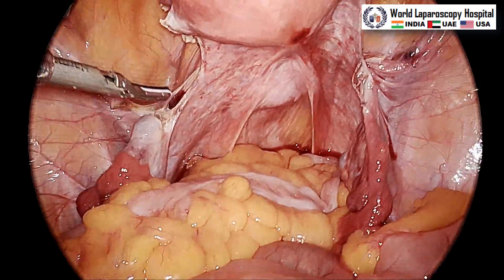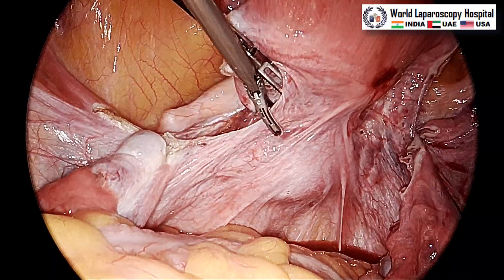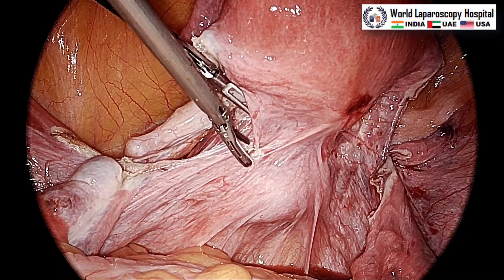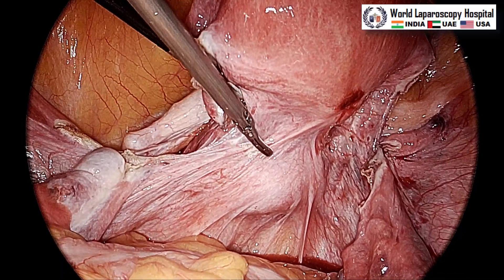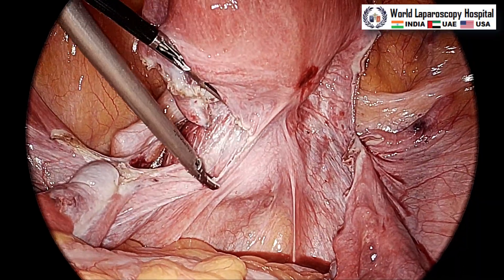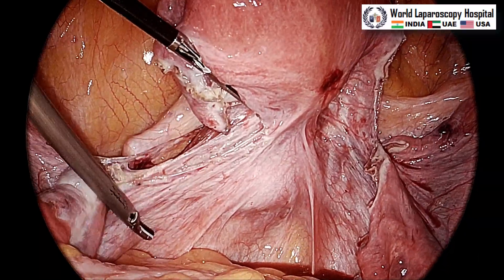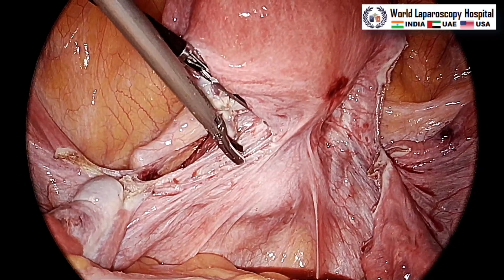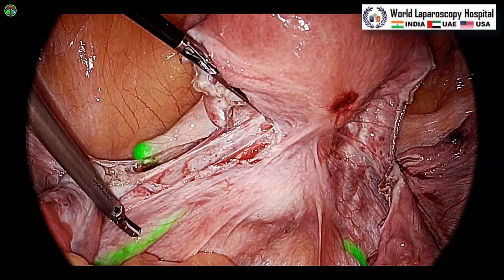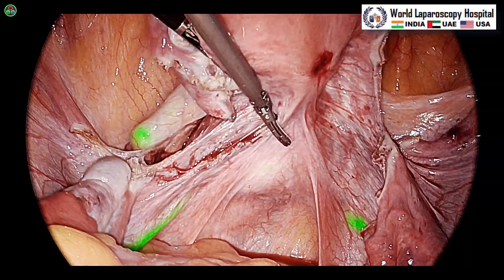Now we will open the posterior peritoneum. The left hand has a great role here — it will lateralize and create the pocket so that you can separate it. Take care that the tip of the harmonic should not touch any vessel, otherwise the vein will bleed. The assistant keeps the uterus initially at one o'clock then moves to twelve o'clock position. Just above the arc of the uterosacral ligament you can open the posterior peritoneum and push it down. In ENV mode, the ureter is visible again.